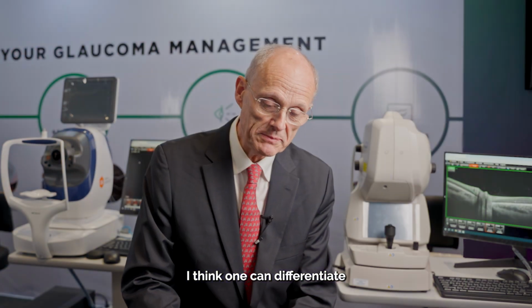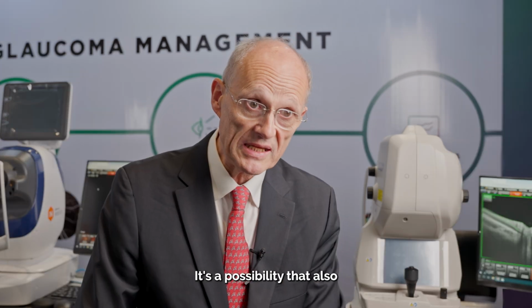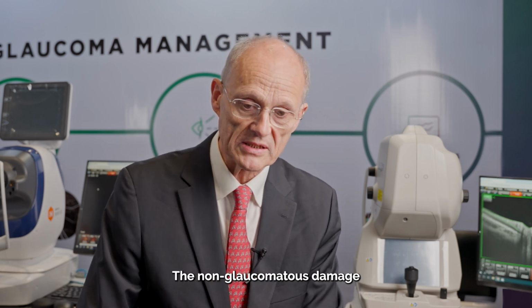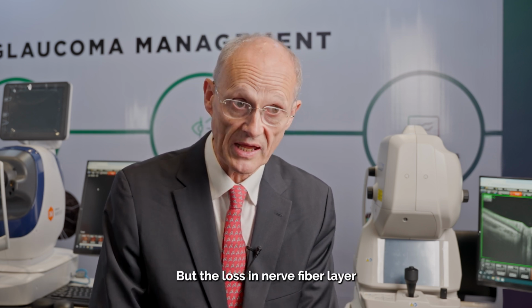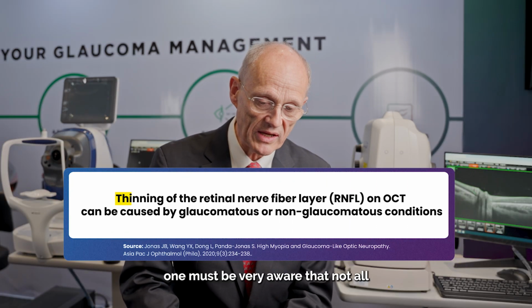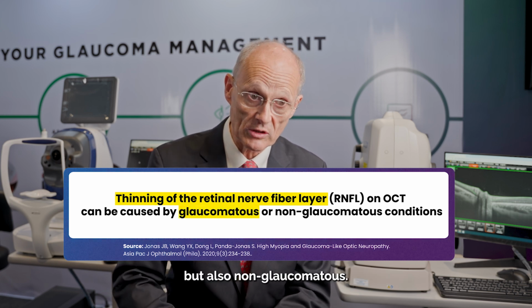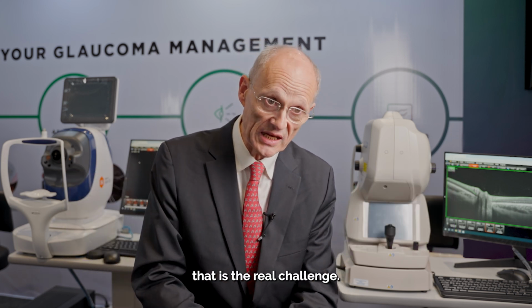I think one can differentiate between moderate myopia and high myopia. In moderate myopia, it's much easier. It's a possibility that also a non-glaucomatous optic nerve damage develops, parallel to a glaucomatous one. The non-glaucomatous damage, with a normal configuration of the rim but a loss in nerve fiber layer and optic nerve fibers, may be due to a stretching of the nerve fibers. With OCT, one must be very aware that not all thinning of the nerve fiber layer is glaucomatous, but also non-glaucomatous. Now, if you go to high myopia, that is the real challenge.